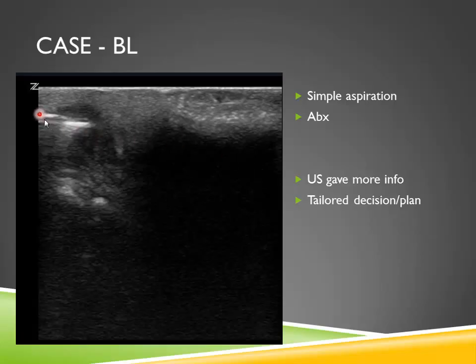So here's actually the needle that's in the abscess, and we drained grossly purulent fluid out of here. You can actually watch it decrease to almost nothing. You can manipulate your needle a little bit to make sure you get all that pus out of there. We treated this with antibiotics, and the patient did well. Didn't require further surgery or intervention. So this is another example of how, using the ultrasound, we got some more detailed info and it helped us make a very tailored treatment decision for this patient. And again, that's what ultrasound can do for you in these soft tissue infections.